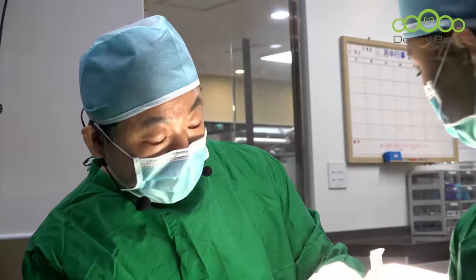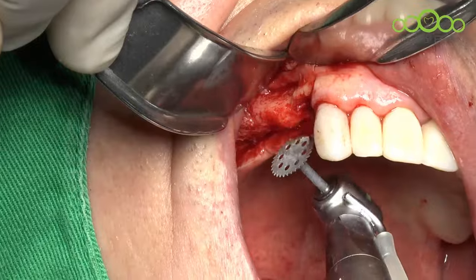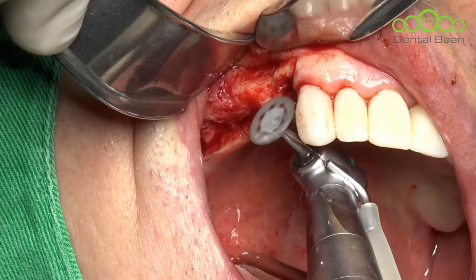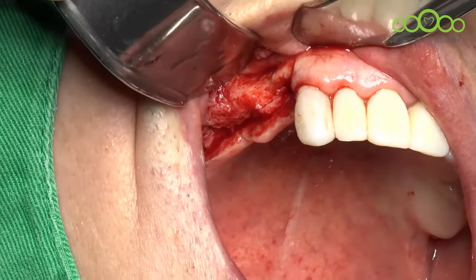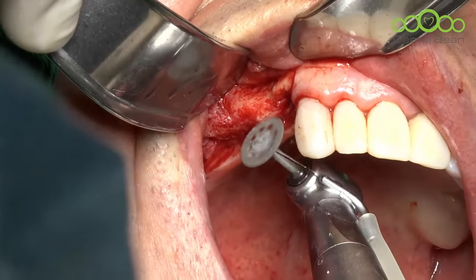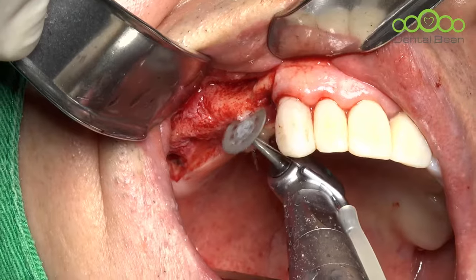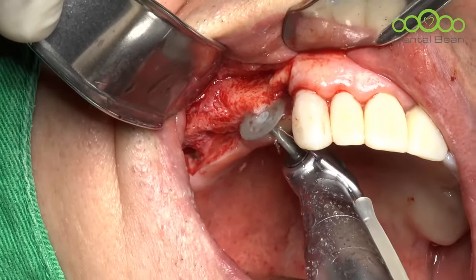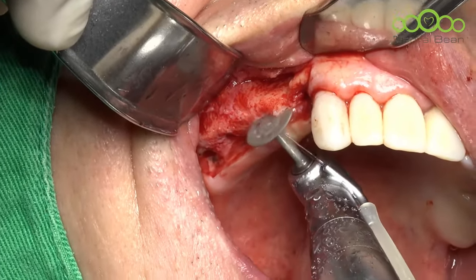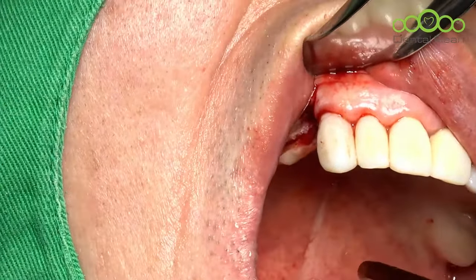So, turn left side. I will use the micro saw first. Okay, here. Bone width looks around 4 millimeter. So, this is an indication of ridge splitting. I'm doing it. Oh, it bounces. I have to change the direction of the saw when it bounces. This is the middle size of the saw. With this one, I'll try the first corticotomy. Then I will use the next size, the big size of the saw.